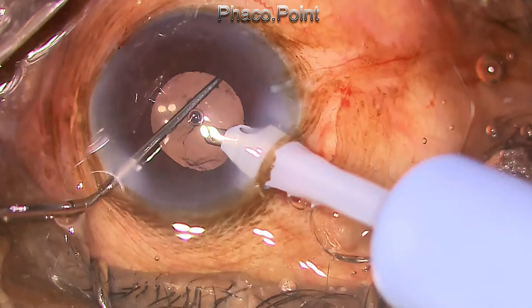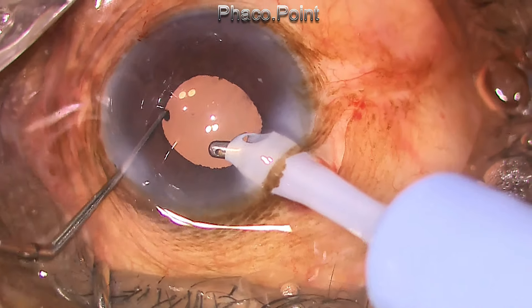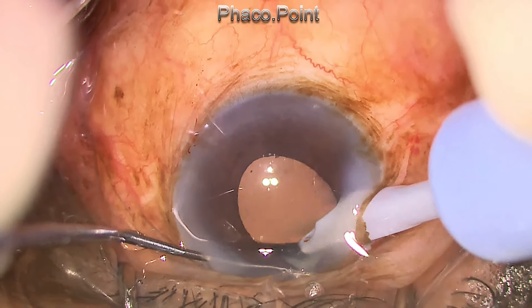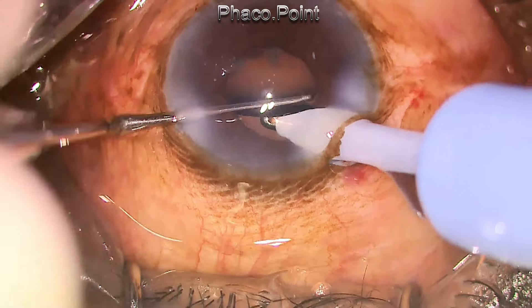Under the scaffold of the intraocular lens, a small pivot rotation of the lens is created. The haptic of the lens sweeps through the equator, helping to dislodge the cortex. This pivot rotation maneuver can be done safely multiple times and has dislodged some cortex. However, the girdle has not yet been dislodged — only some loose cortex has come out. After attempting to remove it, the anterior capsule was inadvertently caught. The lens was then dialed to about 180 degrees to loosen the girdle, and the pivot rotation was tried again — and to great surprise, this maneuver paid off and the entire girdle got dislodged.